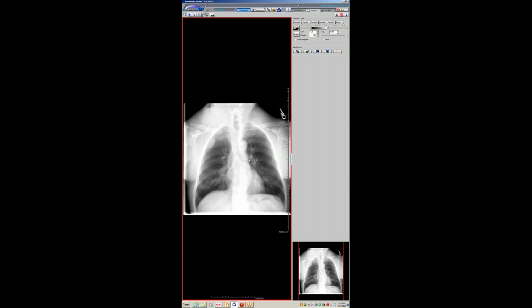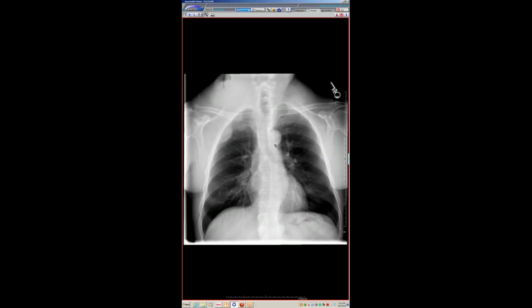Yeah, because I was going with, those nodules are weird. But you think it's restrictive? Yeah. And is there a difference between restrictive allograft syndrome and pathologic PPFE? No, I think that's what it is in the setting of lung transplant. I think it's the same as PPFE from other causes histologically.